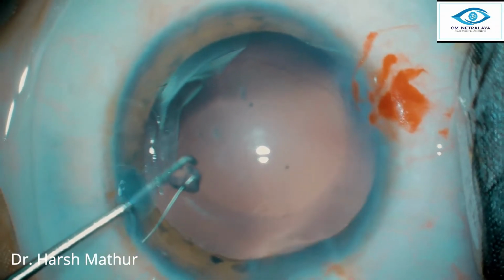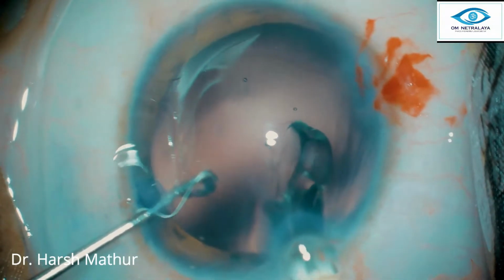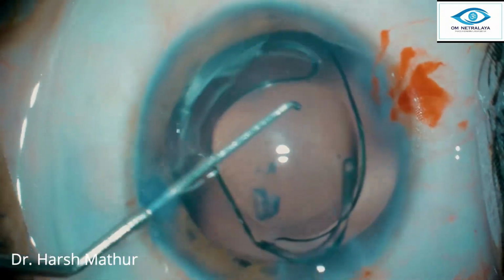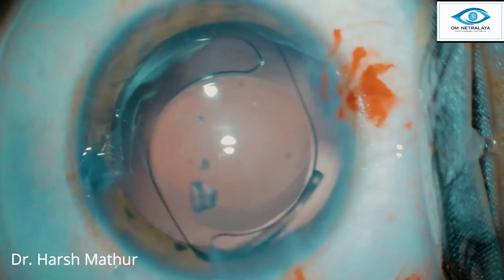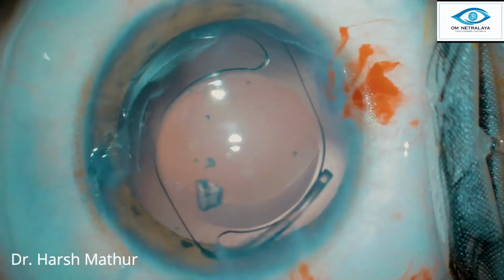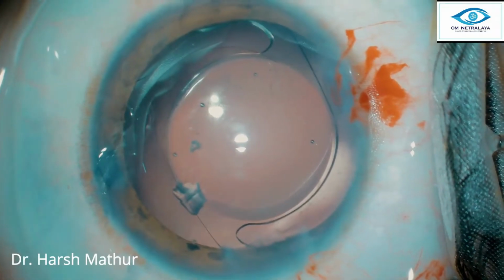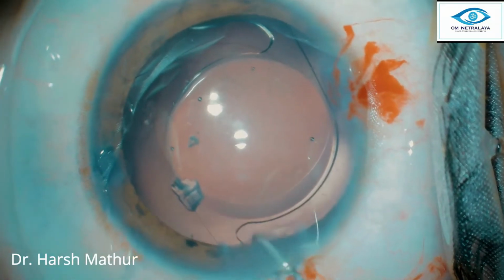Now is the time to inject the IOL, a wound assisted hydrophobic intraocular lens is injected. The leading haptic goes in the bag, and then the trailing haptic is gently dialed in.